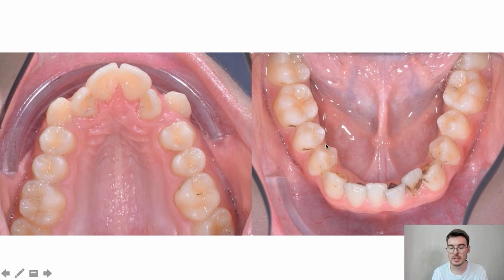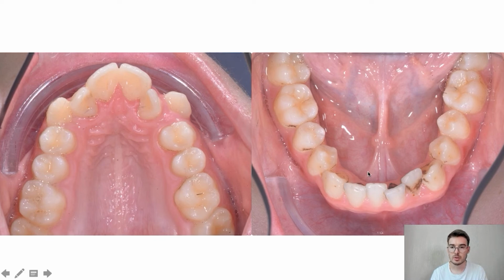And take a closer look at the lower teeth again. See how much they are tilted lingually, meaning that the lower jaw can expand. If we change the inclination of the teeth, the lower jaw will be very, very wide. Do you remember I was talking about the bases of the jaws? You can see it even without calculations and CBCT. Also pay attention to the inclination of the upper jaw here. If we create the right shape of the dentition, there will be some potential for expansion.